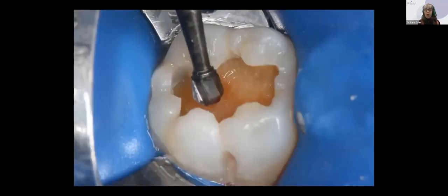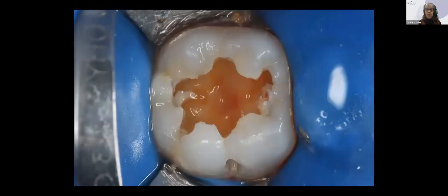So I want to be sure that I have got some very clean margins for this child. So I've gone in and done almost a traditional type of a prep till I got to sound enamel, but I've still got a lot of deep, soft decay. I want to get out as much of the decay as I can without invading the pulp. I want to give my silver an ample opportunity to penetrate to the depth of this. So cleaning it out with a great big round burr, and then I'm going to place my silver onto that.